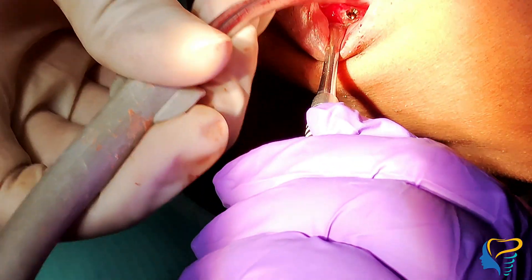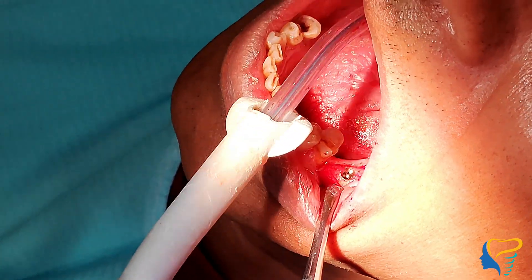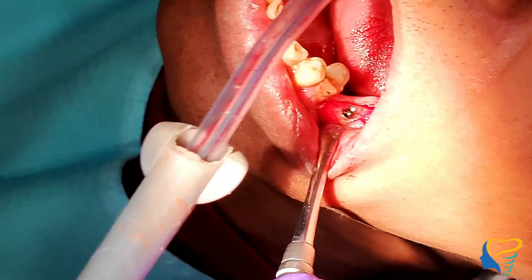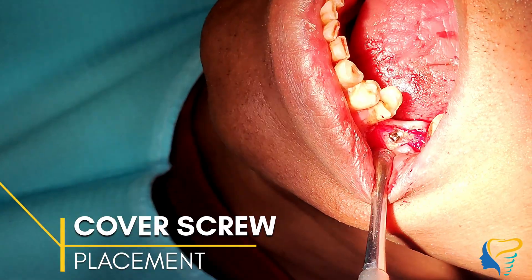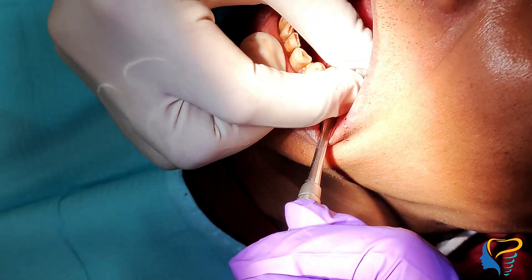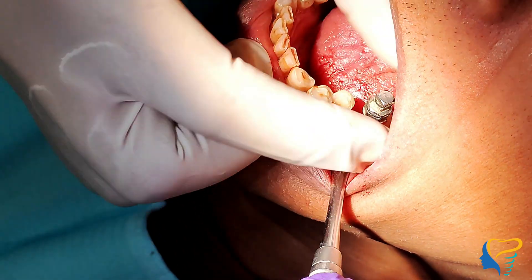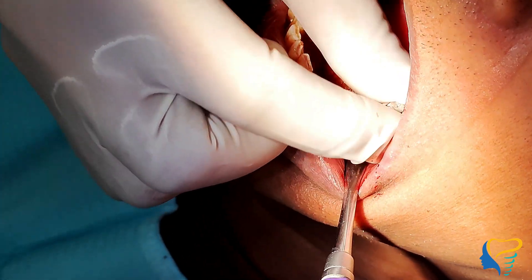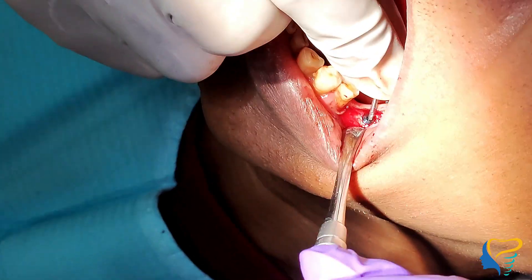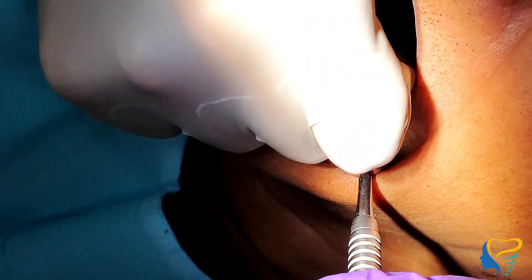As you can see, the implant is placed inside the prepared site. Now comes the cover screw placement, which is placed over the implant to avoid any tissue growth inside it. The cover screw is placed with a torque of 10 to 15 Ncm, or hand torque is also sufficient.